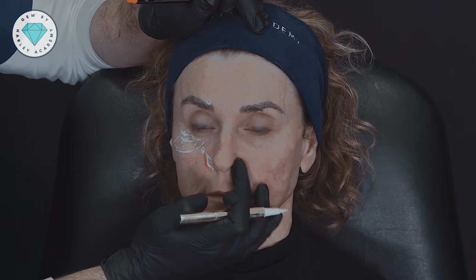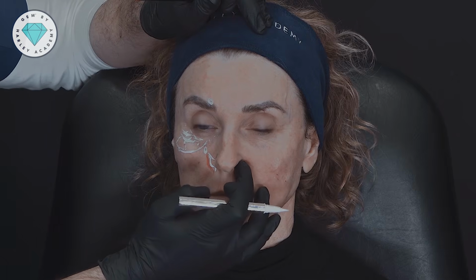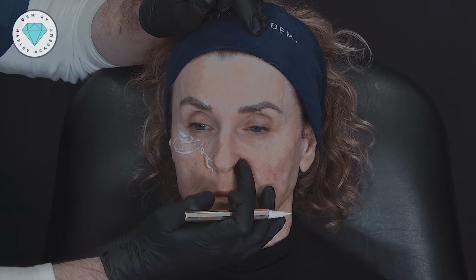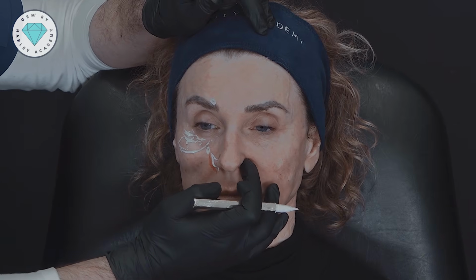And this is a target that we can inject down onto bone. If I palpate here, I don't actually notice there's a significant degree of recession of the maxilla. So normally this would be a very good target in a deep midface sequence. In this case, I'm not convinced it will add too much value, and so I'm actually not going to treat the deep piriform space.